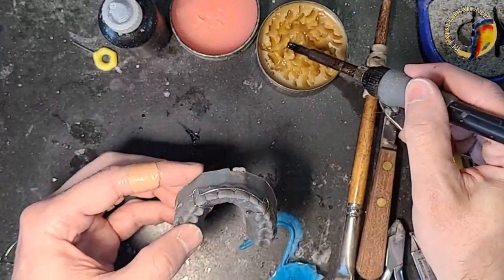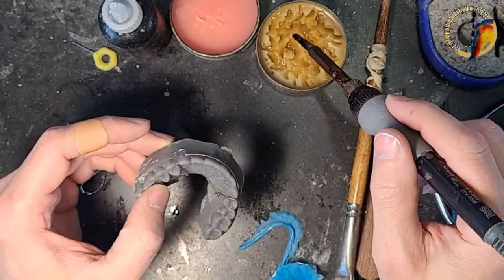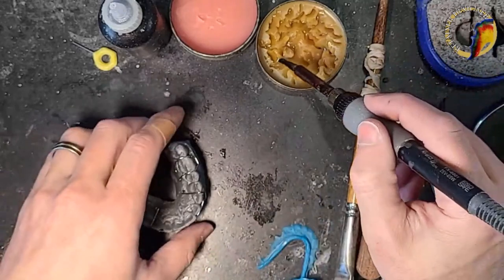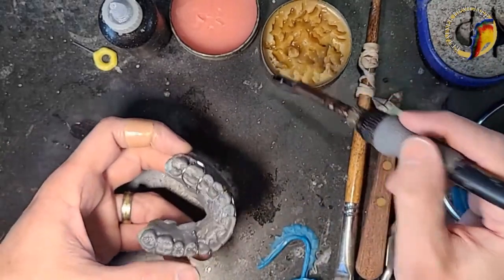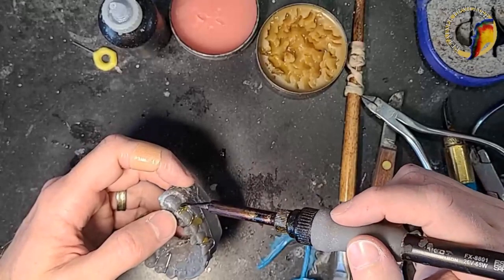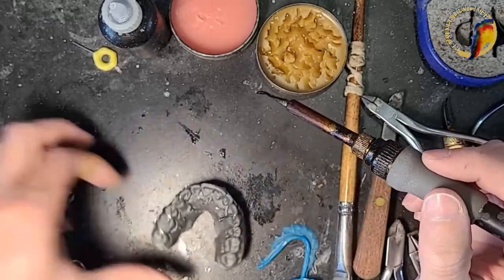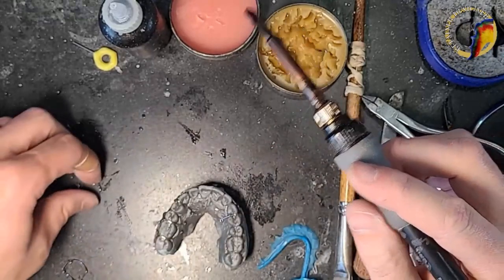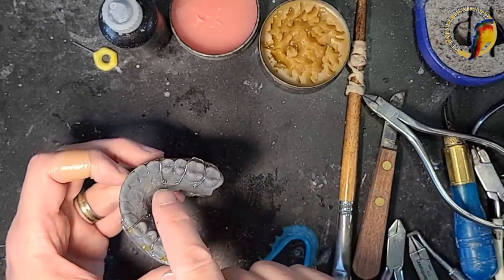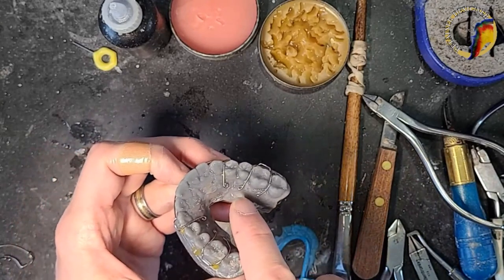When I got a text from the assistant, he asked 'Do you do all the colors on your color chart?' I said yes, I carry all the colors — some are definitely more popular than others. Notice how short I had to make my wires on this one.